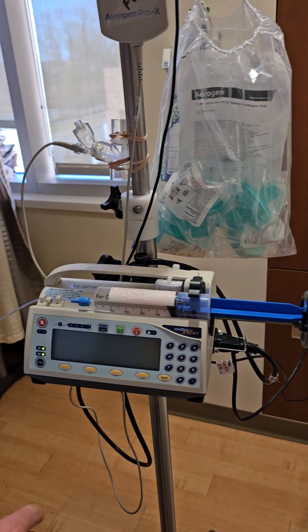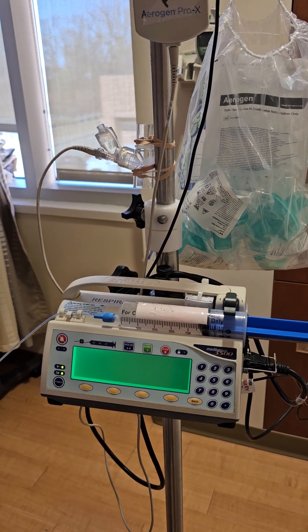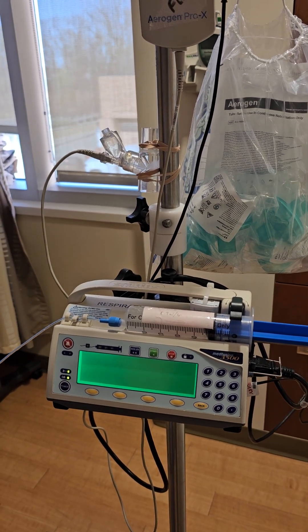Secure the plunger of the syringe like that. We're ready to turn the machine on — we'll do that with the power button right here. This is going to take a minute to initialize, so we'll spare you that minute.